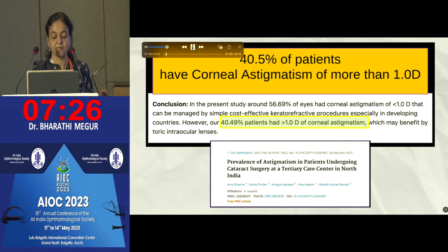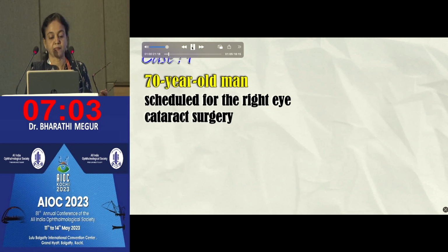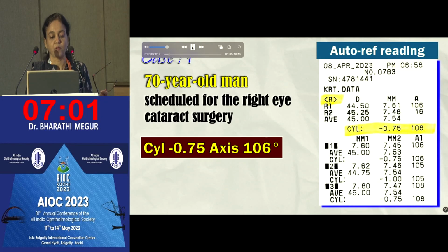As we see, the scale of the problem is that almost 30% of cataract patients who require surgery would require a toric IOL. This would mean every 2 to 3 patients out of 10 would require a toric IOL. This is justified by all the data and statistics obtained from the journals. At least 30% of our workflow would require a toric IOL.